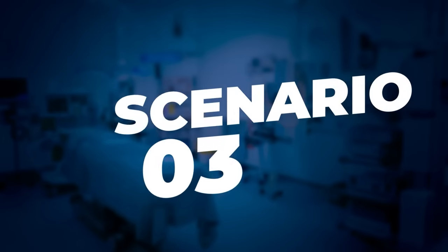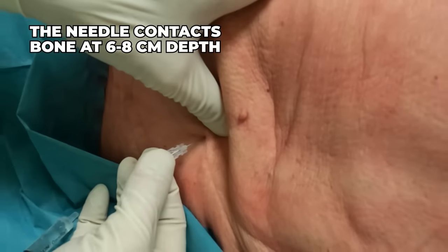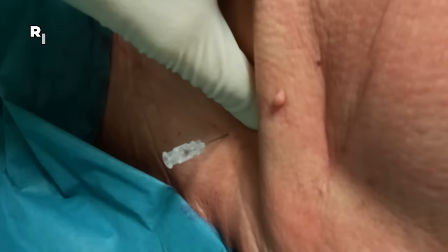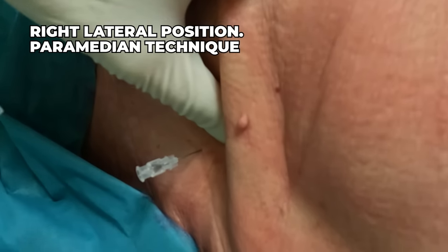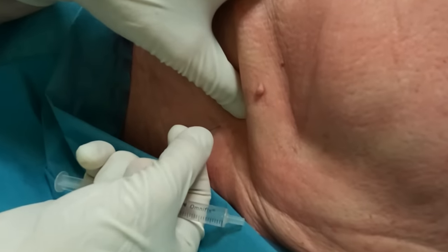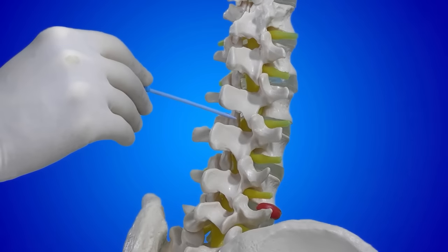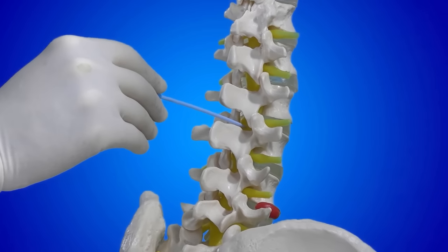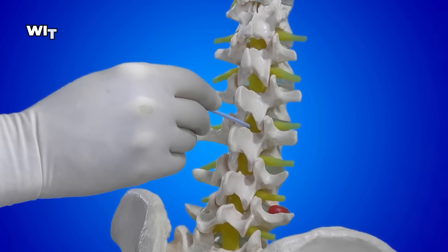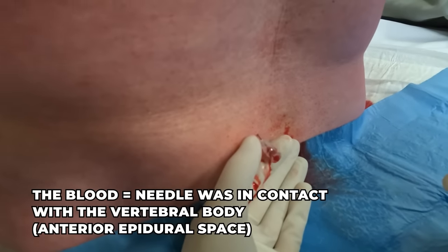Scenario number three: the needle enters up to six to eight centimeters and touches bone. In my clinical observations, practitioners in this situation tend to abandon the procedure and take the needle out. But in fact, if you touch the bone at six to eight centimeters, it means you have missed the dural click — you were in a correct position but passed through the subarachnoid space. What you need to do is pull the needle back by one centimeter and watch for CSF to appear at the hub of the needle.